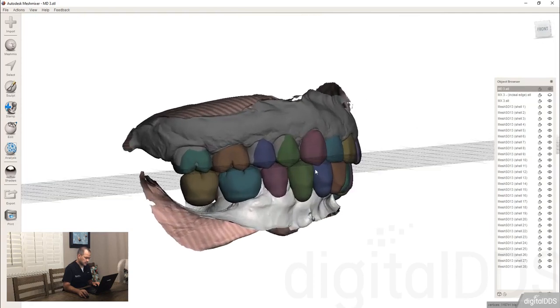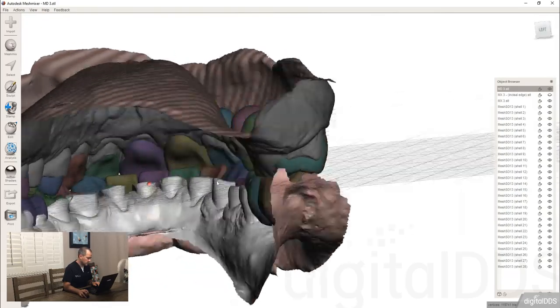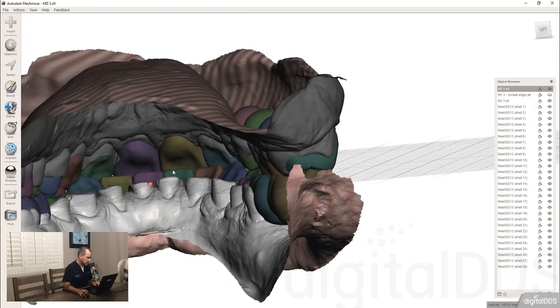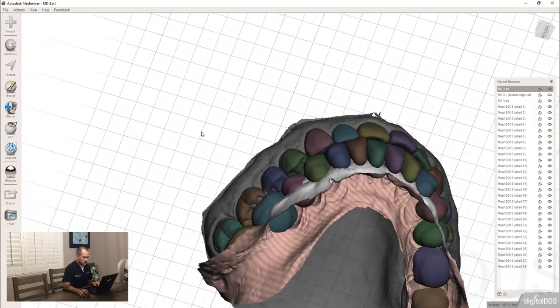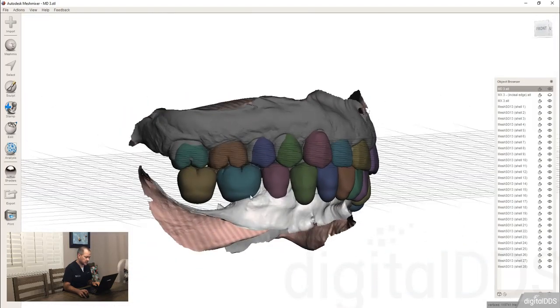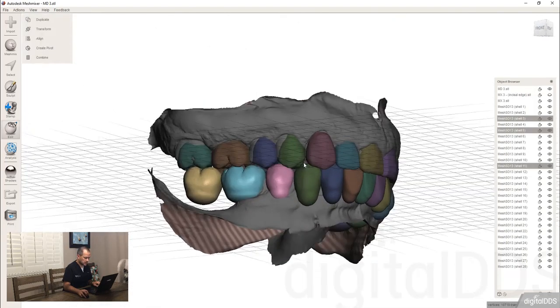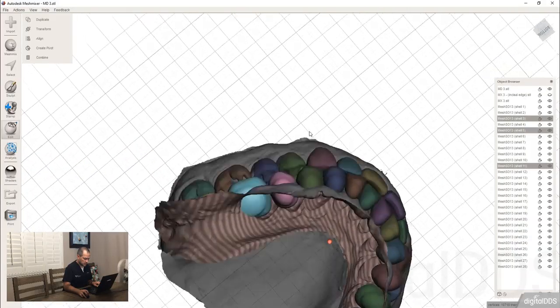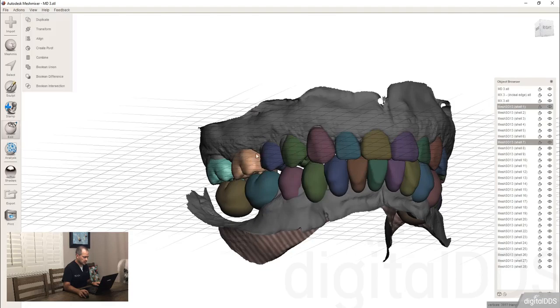The idea I want to show you is that if we turn back on our mandibular arch, okay, let's say that we set these teeth and we're happy with them, but we're looking at the teeth and the patient and realizing that we need to change the vertical to make this possible. For one, the very first thing we notice with this patient is that, here, let's do this.